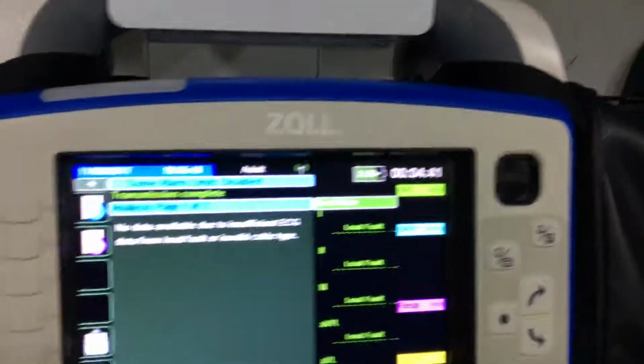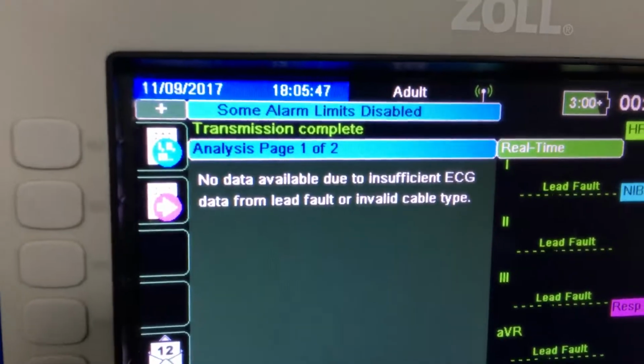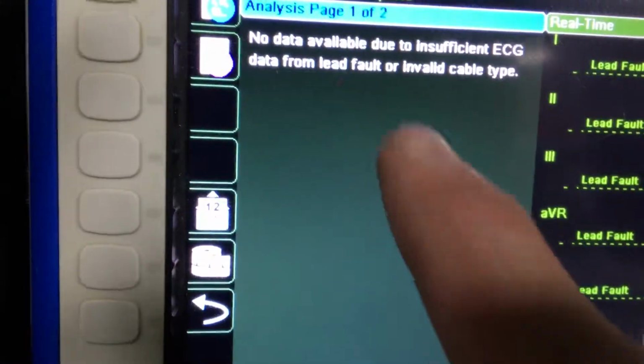Sometimes it fails. Again, you're using wireless Wi-Fi using Verizon, so it may or may not be a good connection. So if it didn't work, it'll say transmission failed, and you can do it again. There it is. You can do it again as long as you don't exit out of this screen.